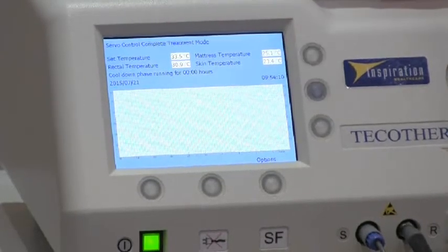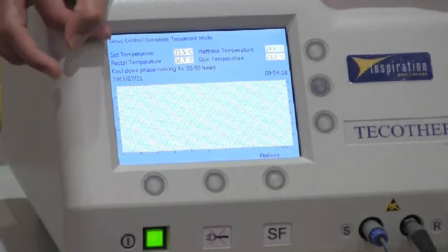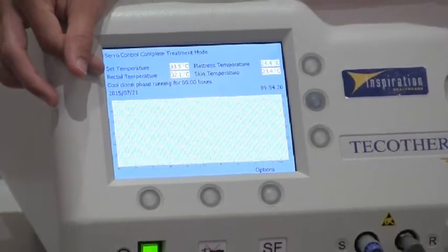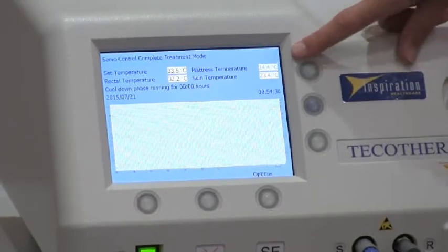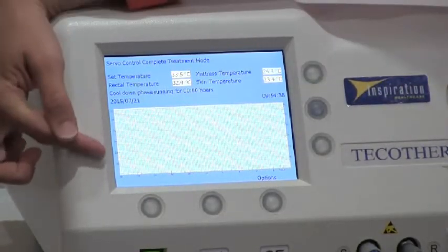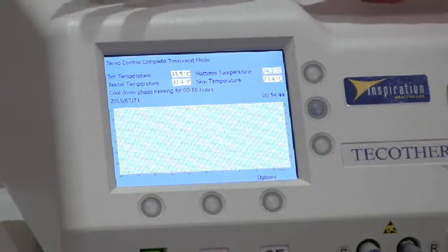You are now cooling the infant. On the top of the screen, you have your set target temperature — typically 33.5 degrees. Underneath you have your measured rectal temperature, shown in green. On the other side, you have your mattress temperature and your skin temperature. Throughout treatment, the graphical display will show each of these parameters in a different colour so you can see exactly what temperature each parameter is at.